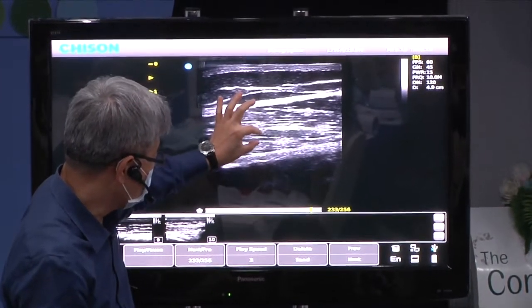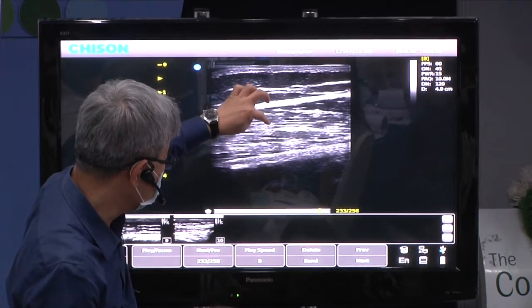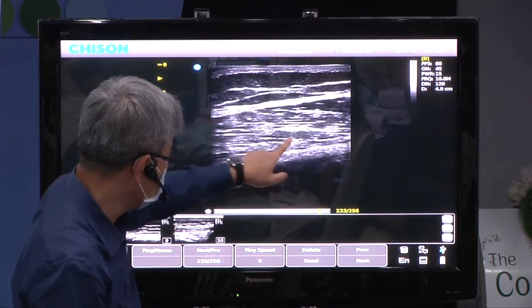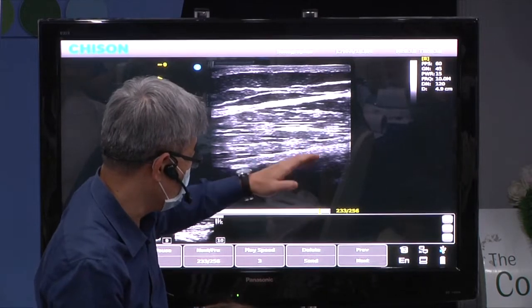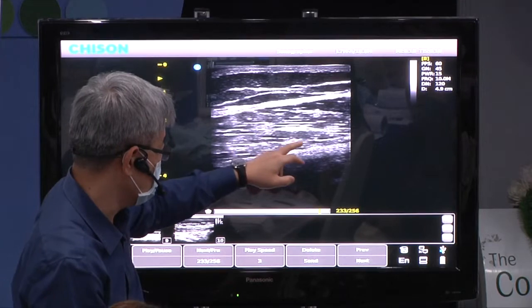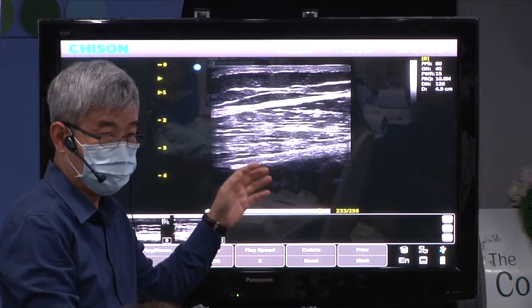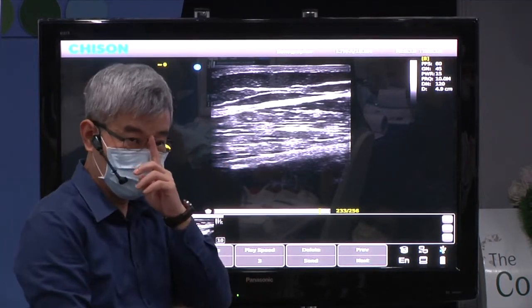You can pick out 3 in the middle, 1, 2, 3, yeah. You can extend the line. Maybe the line goes out of range in the window, but it is accepted in research. Then you pick out 3, average them, and report that as the pennation angle in the vastus lateralis.